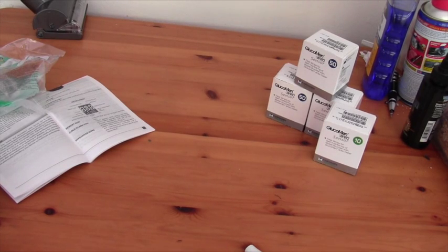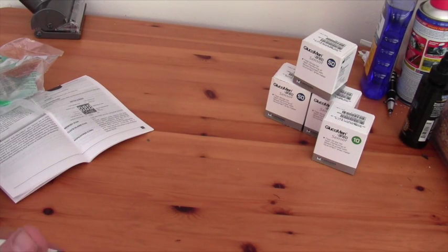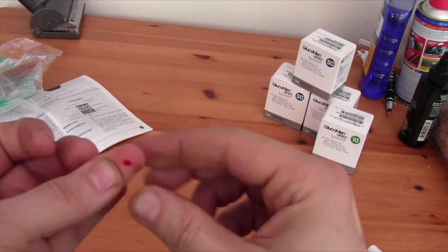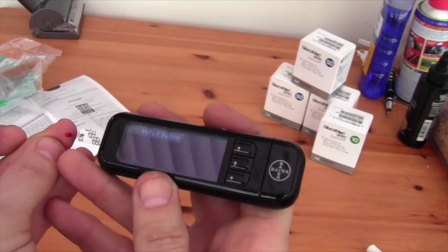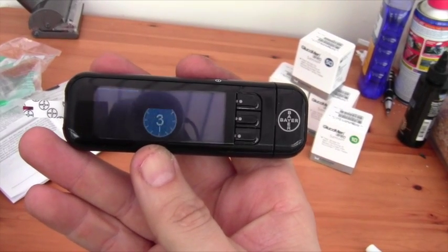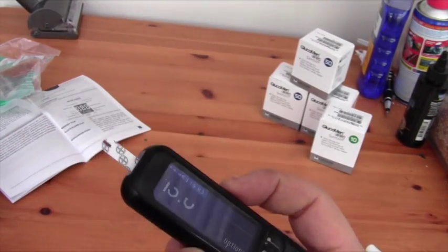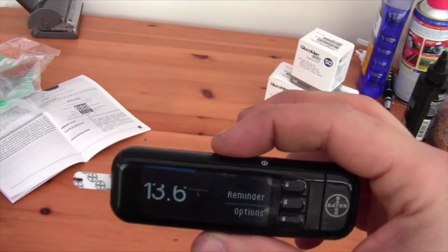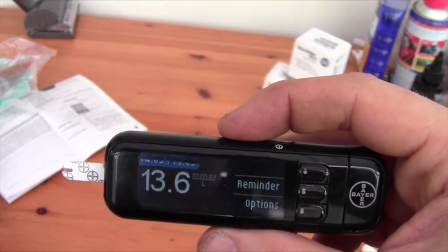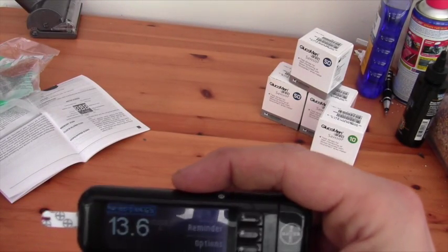As I just had quite a high reading, I'm going to do a test on my Bayer just to see how the readings compare. You must remember there's always going to be a certain amount of tolerance in these things, so I wouldn't expect an exact reading, particularly not at the higher levels. It says 13-point-something on the Bayer. The tolerance allowed is about ten percent — that sort of falls within that. They're supposed to be more accurate below 7.